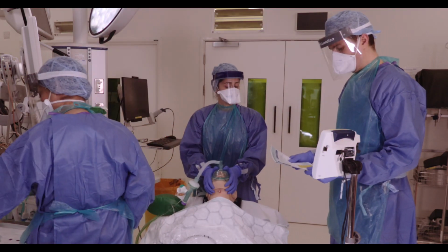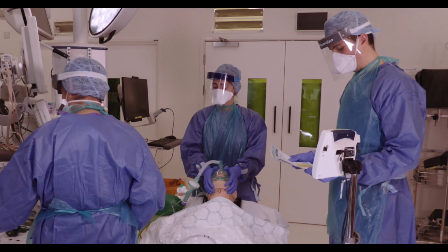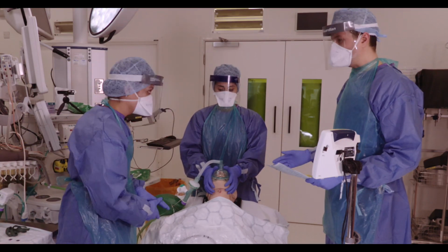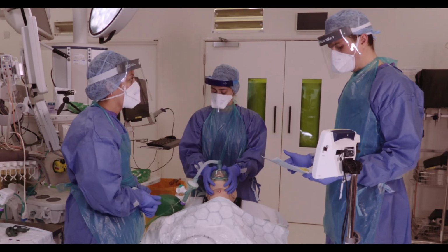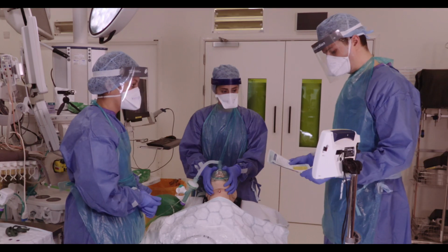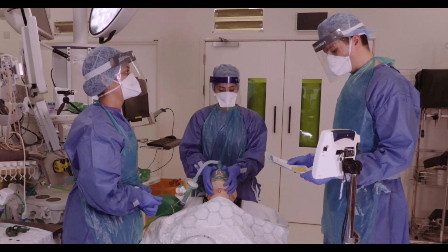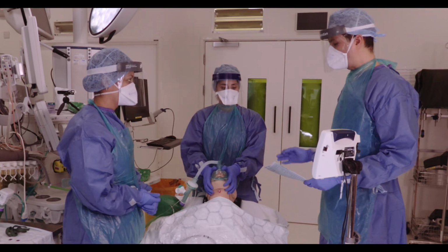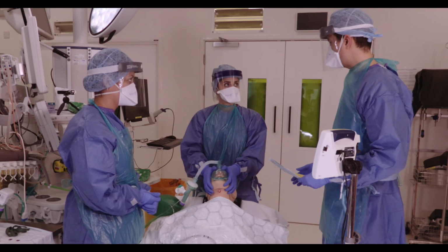Okay, so what we're going to do is give the drugs, we're going to have 60 seconds of apnea, then we're going to perform intubation. Our first plan is video laryngoscope, we've got everything set up for that. Plan B will be supraglottic airway, plan C will be 2-person face mask ventilation, plan D will be front of neck access.